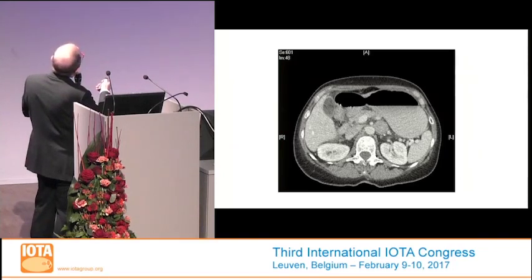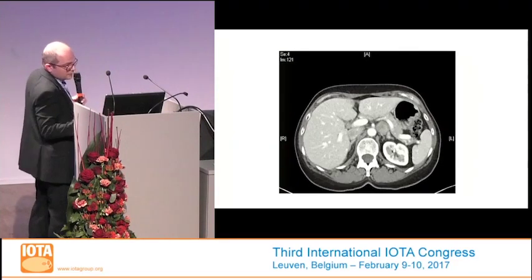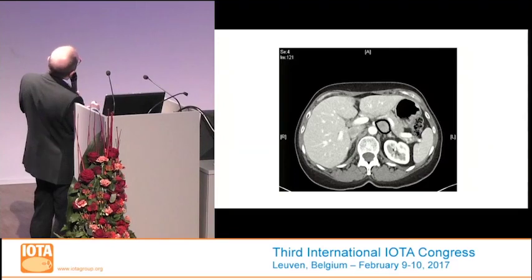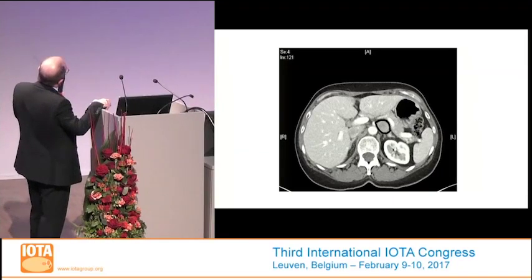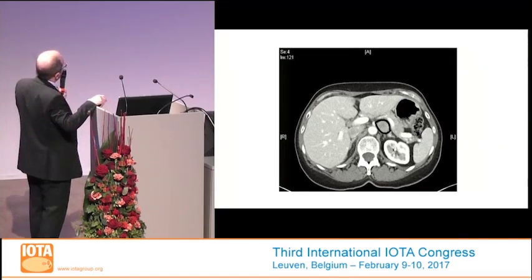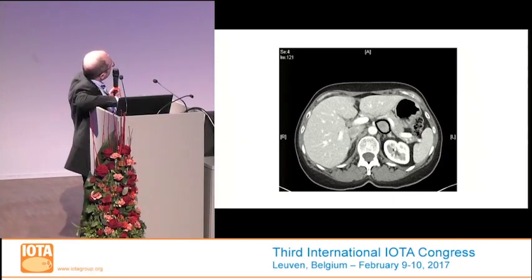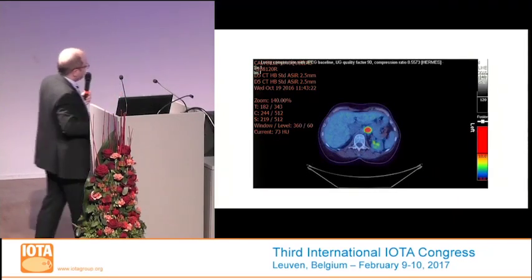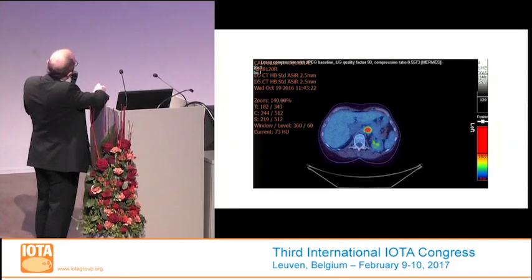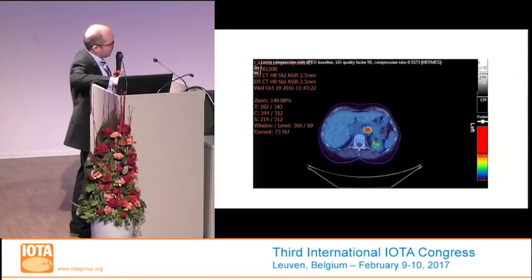I think they are referring to this, probably. Yeah, there, you can show. They describe that it is below the splenic artery, close to the celiac trunk, and close to the left adrenal gland. So the CT report suggested that it could actually be a paraganglioma. So this is on the CT PET. So what's the next step? What do you think? This biopsy is difficult.